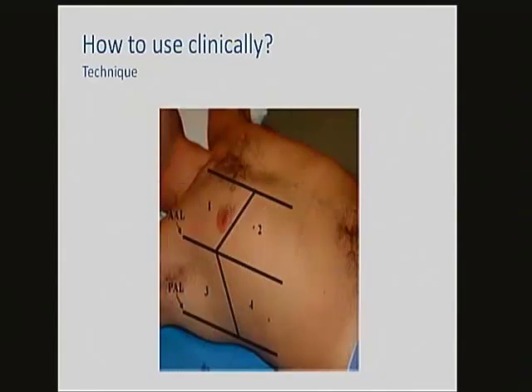The way we really usually look in the emergency department is we look in the 4 zones, kind of up, superior segment, middle segment, and then 2 lateral segments. And we just try to see, are there more than 3 B lines in each of those segments? The nice thing is that the more B lines you see, the more fluid there is. So if it's bilateral in all the segments, it's very specific for CHF.